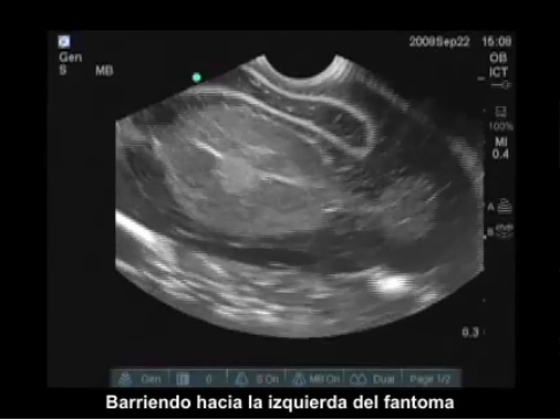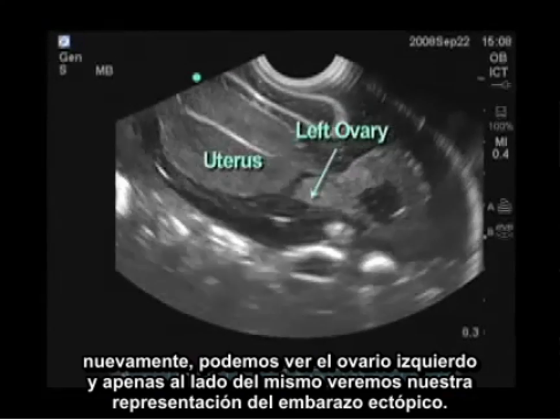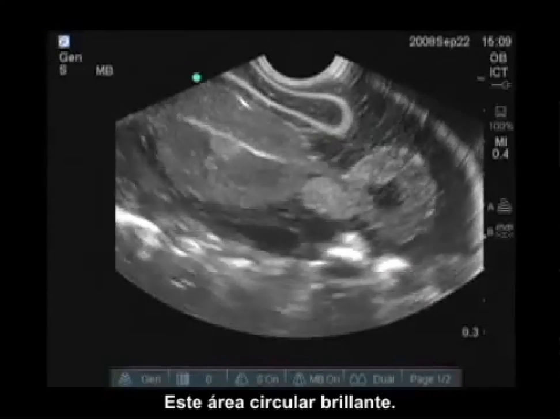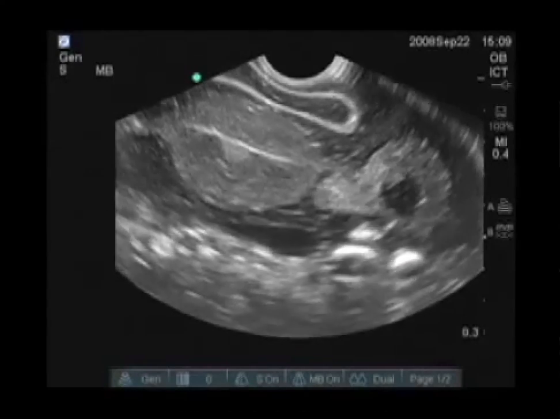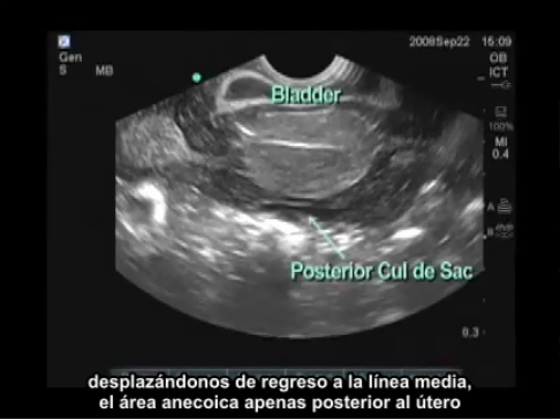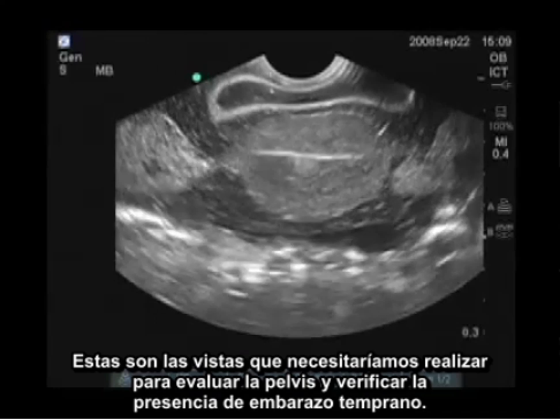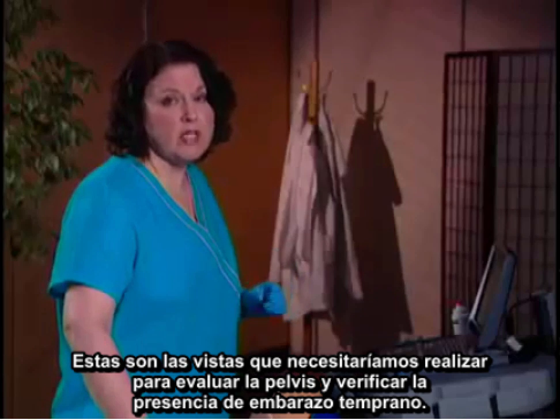Scanning over to the left of the phantom, we again see the left ovary, and right beside it we see our representation of the ectopic pregnancy — this bright circular area. Moving back towards midline, the anechoic area just posterior to the uterus represents free fluid or blood. Those are the views you would need to do a thorough assessment of the pelvis for early pregnancy.